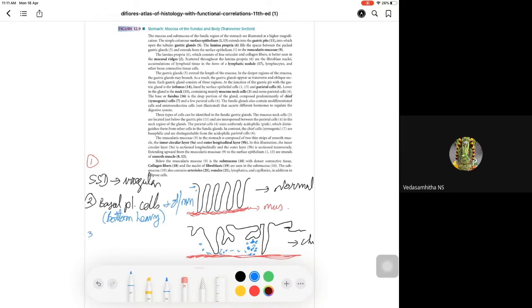Number three is granulomas. Number four is an increase in certain WBCs, for example, eosinophils. When you see 5 eosinophils sitting together, remember the number 5, or if there are more than 15 eosinophils within one high power field. Let us see, these are eosinophils, 5 of them sitting together, or imagine this is one high power view and you see 15 eosinophils within it. These are all the criteria for chronicity. Granulomas are not a must.